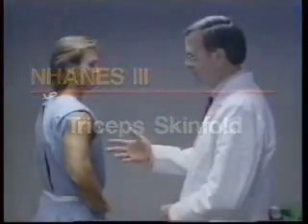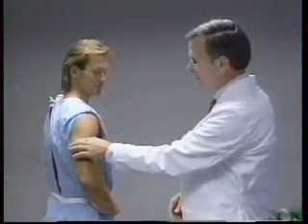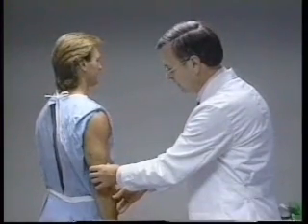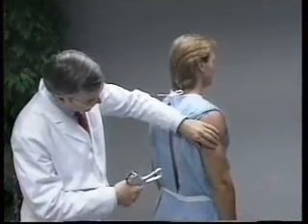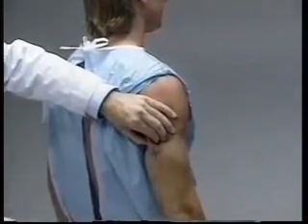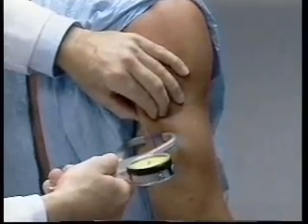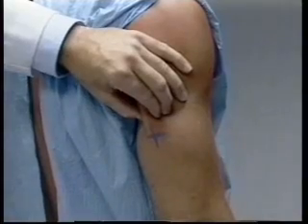The tricep skin fold is measured on the right upper arm at the point previously marked for the mid upper arm circumference. The subject stands upright with feet together, shoulders relaxed and the arms hanging loosely at the sides. The technician stands behind the subject and gently lifts the tricep skin fold, with fingertips centered just above the mark. The tricep skin fold is held parallel to the long axis of the upper arm. The tips of the caliper jaws are placed perpendicular to the length of the fold, two centimeters from the fingertips, and centered over the marked point.